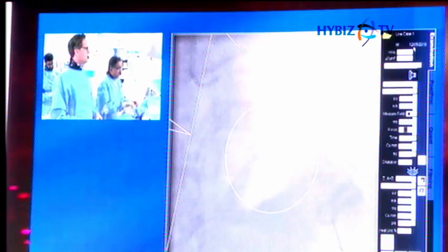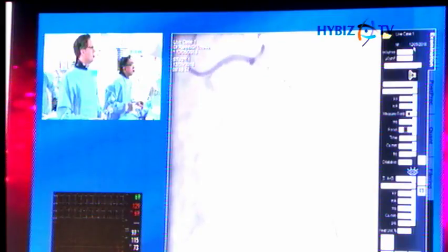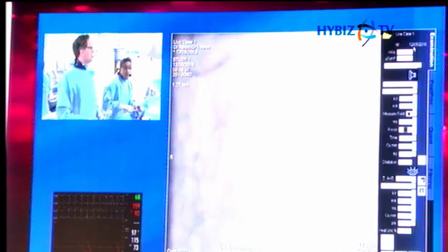I'm just going to do a quick angio so you can see what we've achieved. Can you go to normal magnifying, actually, normal, yeah. Looks great. Some more contrast. And now we're going to post-dilate with a 3.5 device, and 6.5 millimeters.